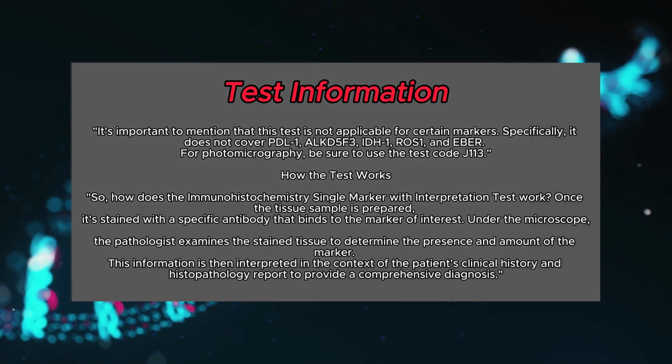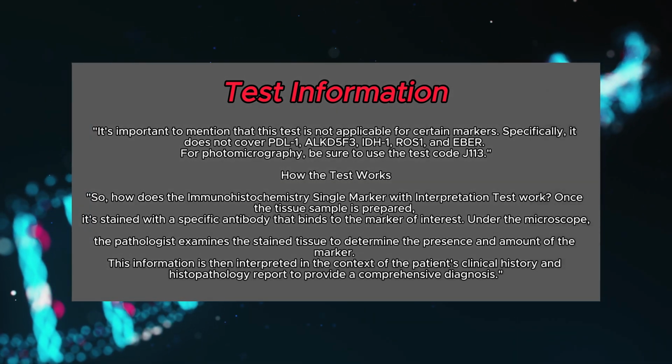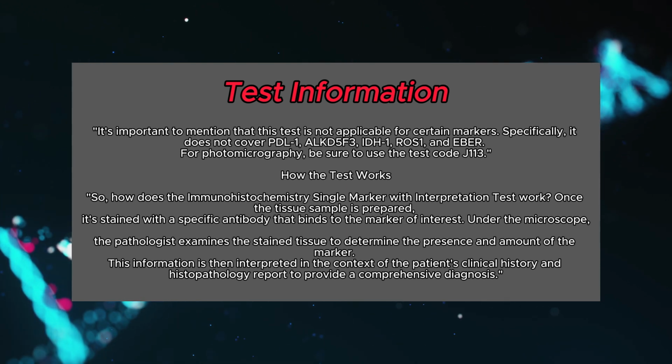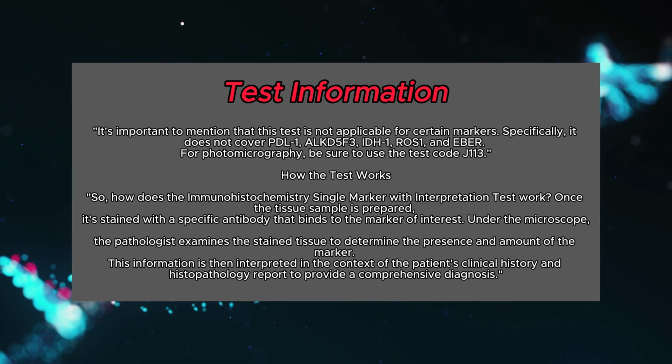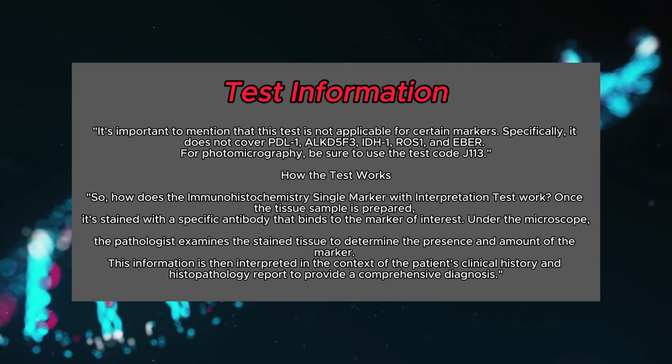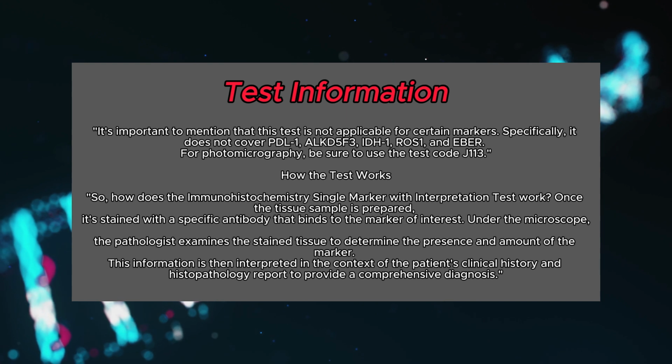Test information. It's important to mention that this test is not applicable for certain markers. Specifically, it does not cover PD-L1, ALKD5F3, IDH1, ROS1 and EBER. For photomicrography, be sure to use the test code J113.